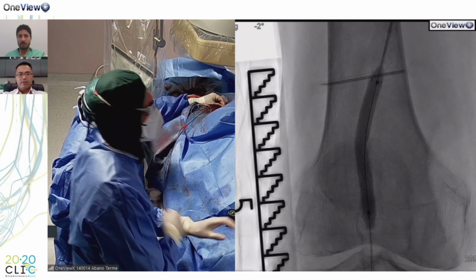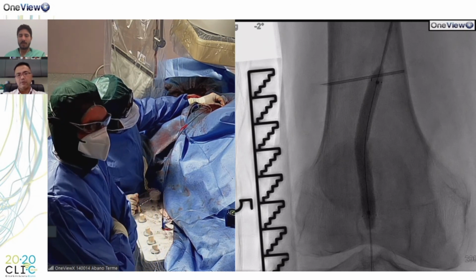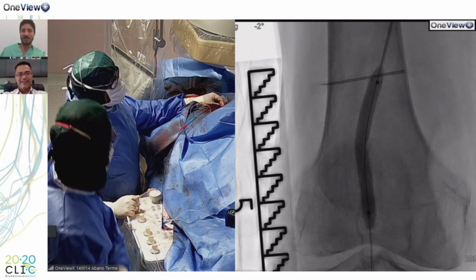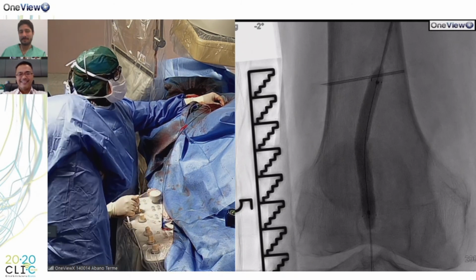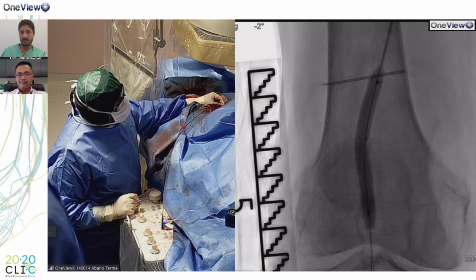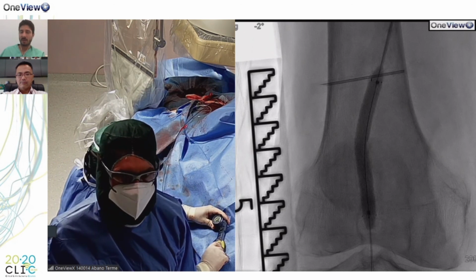Amazing, the patient has no pain because of the nerve anesthesia. I think this is very comfortable for the patient. No tachycardic response, no adrenergic response. Yeah, exactly. But also, if there's a perforation, you don't see it. Yeah, that's true, but maybe not good to say that. We perform a sciatic block, but below the knee, with the popliteal access, not higher. Clear. So could feel pain at that point also.